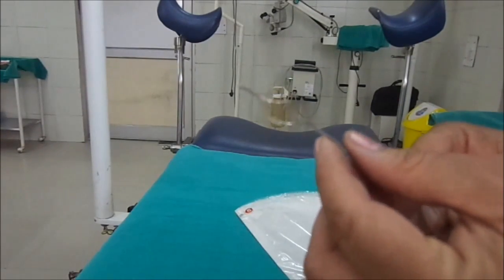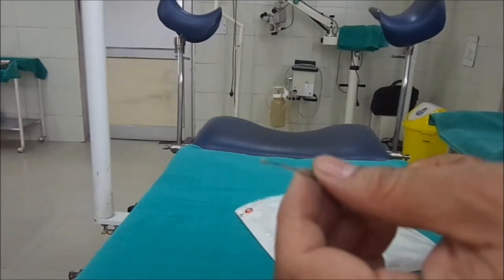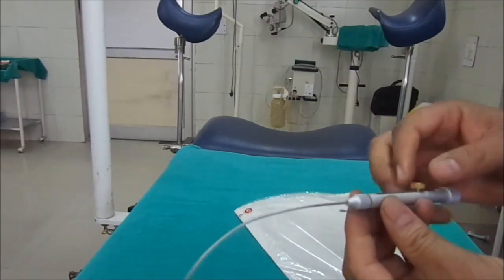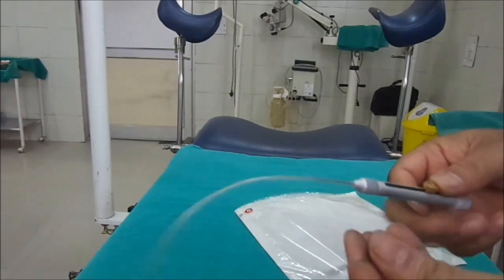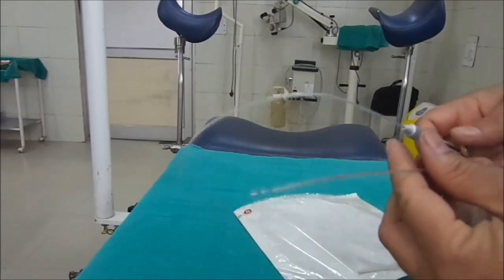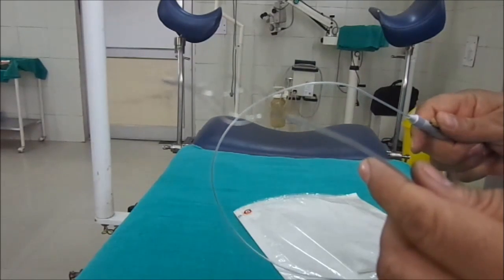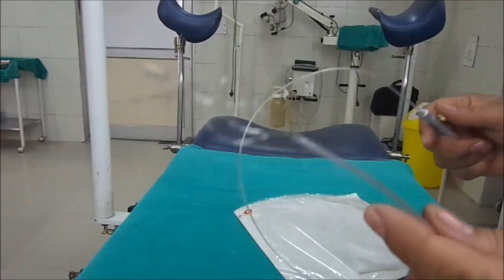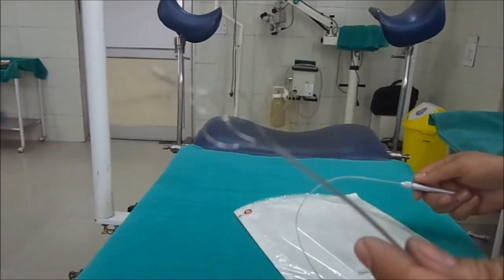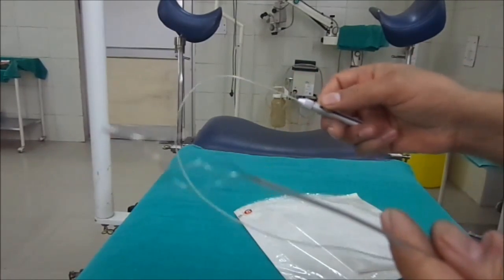You can see the wire and the loop that is formed by opening this wire. This is the control from where we open or close the basket. By moving this switch apart, the basket is opened.